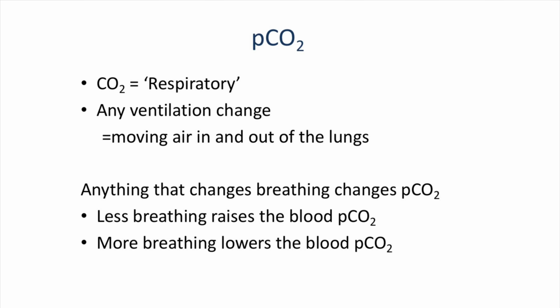The opposite is also true. If we suddenly start breathing more and more, we will get rid of more CO2 in the lungs, and so therefore the PCO2 levels, the CO2 levels on the blood gas will go down.